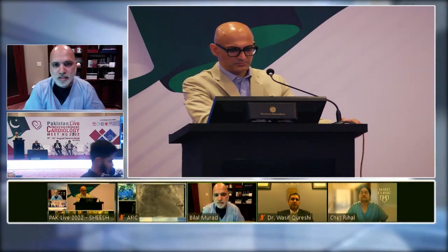And then what we don't know, of course, is what is the outcome of valve in valve in the long term. TAVR in TAVR valve. We don't know exactly how long the TAVR in TAVR will last as well. So those are all questions that are emerging, but I suspect that as the technology gets better and better and we have more evidence of longevity, this technology will be applicable in younger and younger patient populations. So hopefully that answers the question.